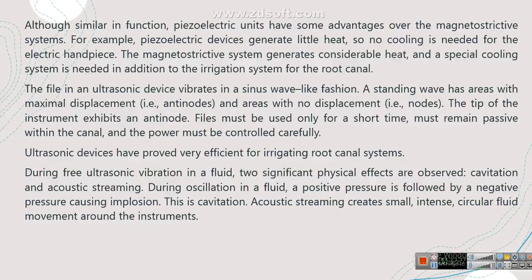A standing wave has areas with maximal displacement, that's to say antinodes, and areas with no displacement, that's to say nodes. The tip of the instrument exhibits an antinode. Files must be used only for a short time, must remain passive within the canal, and the power must be controlled carefully.